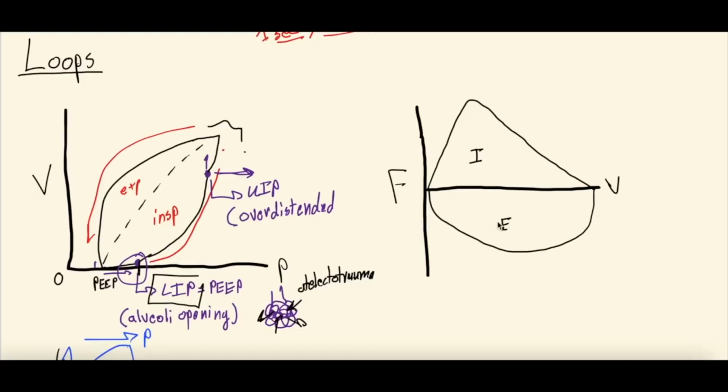There's not much to say about this loop until we talk about pathology, but a few things that you might notice with the flow volume loop would be something like a sawtooth pattern, or the scoop pattern, which is kind of scooped. And these mean different things, whether it's obstruction or mucus or what have you. And again, look for that future video for that. But the flow volume loop, you want it to follow this nice inspiratory, expiratory contour on the ventilator when you look at that loop.